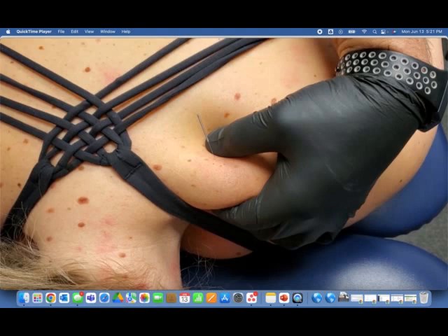We can drop a needle like here where we did here. We can put one on the other side, or we can put one a little bit further laterally and apply some stim and not abuse this tissue, not be traumatic to it, and simulate that twitch and still get the same or if not better results, simply because we didn't put undue trauma into that area.